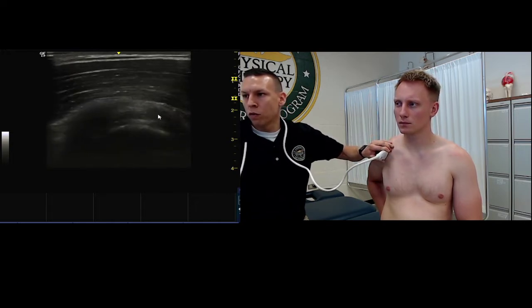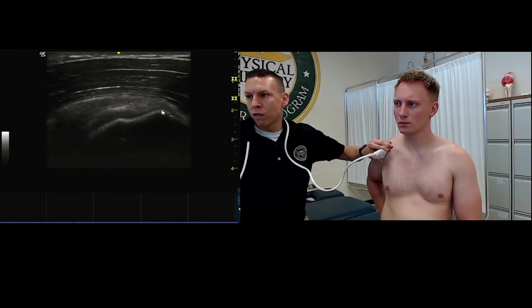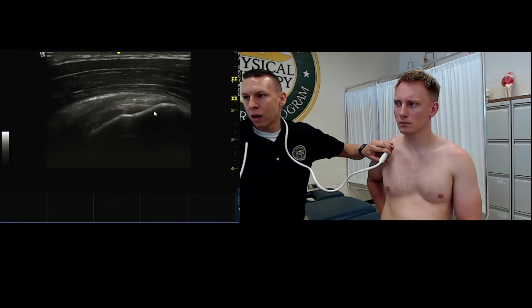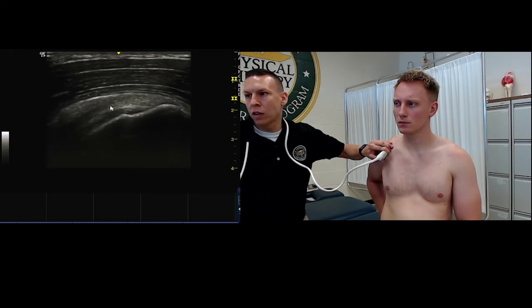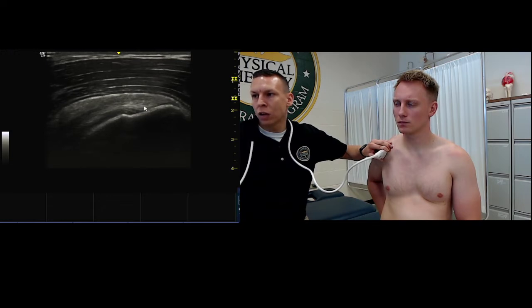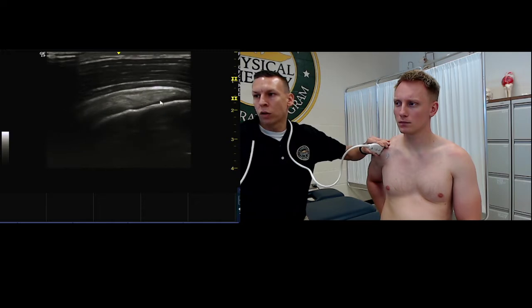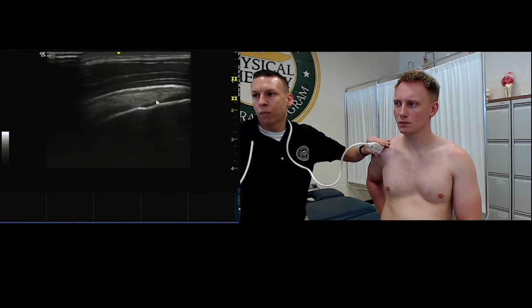So again, we want to move anteriorly all the way to the biceps tendon. Find this S-shaped curve here. Identify some of these fibrillar fibers coming down, attaching. And then we want to slide our probe all the way posterior where it starts to flatten out.